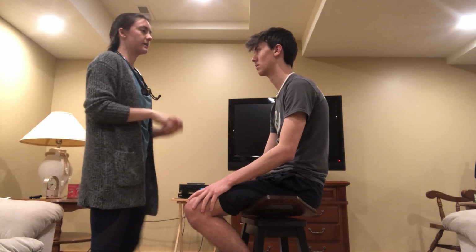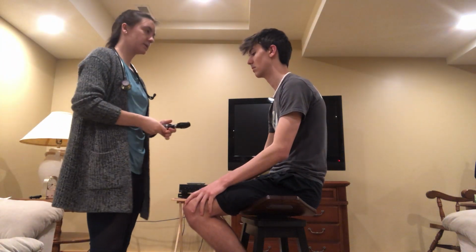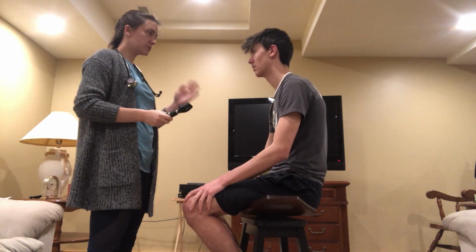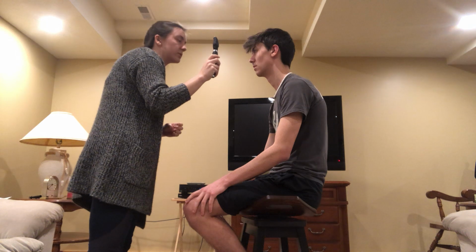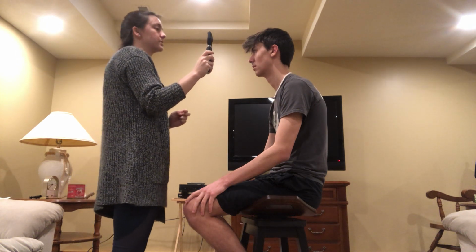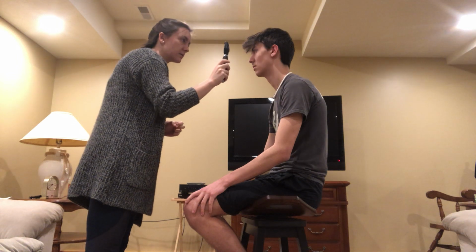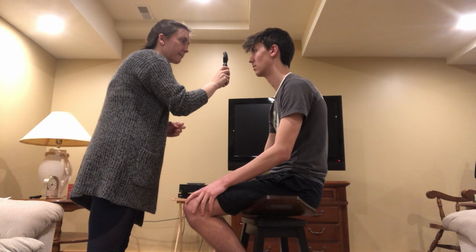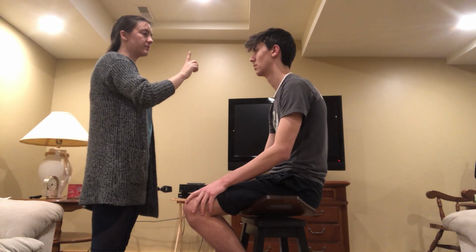Okay. And then I'm going to use a pen light or my ophthalmoscope in this case to inspect my patient's cornea and conjunctiva. And I'm also going to assess his pupillary reaction to light both directly and indirectly. Okay. Good. And I'm going to assess my patient for accommodation. Go ahead and follow my finger in, okay?